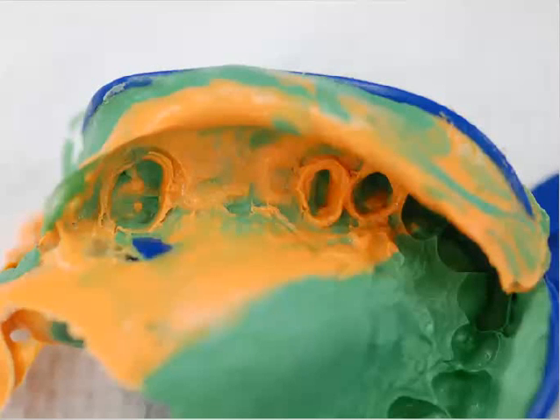That can create all sorts of problems of disparity and discrepancy. The margins are not even well formed. It can really lead to a massive failure when it comes to trying to get this into place and have good marginal adaptation. We have to be alert to that.